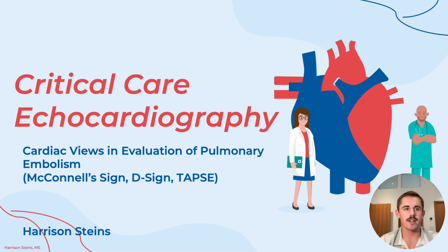My name is Harrison Steins, and today we'll be looking at cardiac views and evaluation of pulmonary embolism using some things you may have heard of: McConnell sign, D sign, and TAPSE. You may have heard of these if you've ever trained with like a FAST exam before.